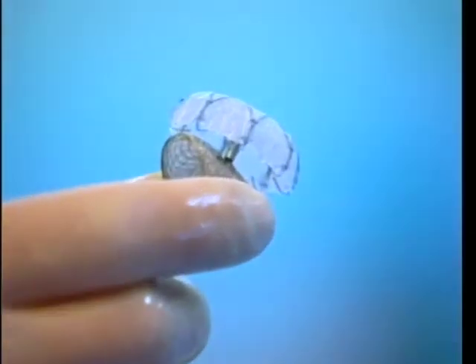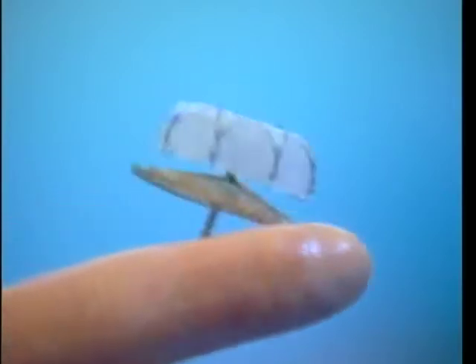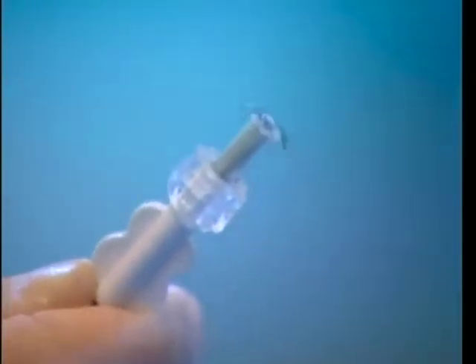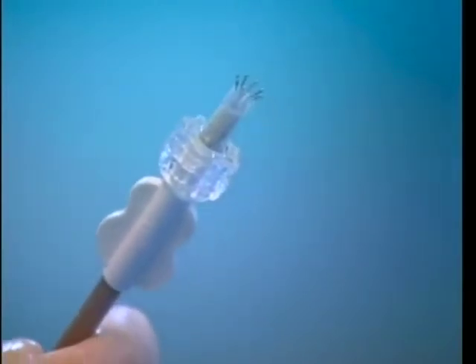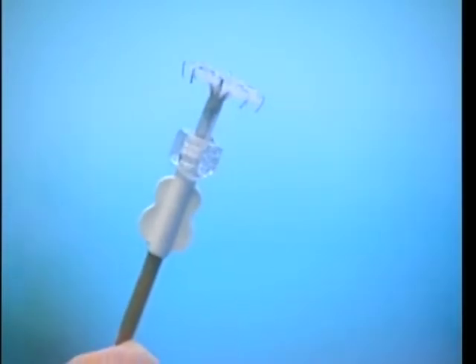So now, oh, that's very good. Now keep it still and then pull it back into the sheath or the loading tool and show us how it comes out, because that's an important difference to all the other devices. It's just like an umbrella. You see here? It is rolled out. And these big hooks are actually not designed to get into the wall. Well, they will also prevent embolization, but actually the small hooks which come out now, keep it still, the small hooks are designed to engage the wall.